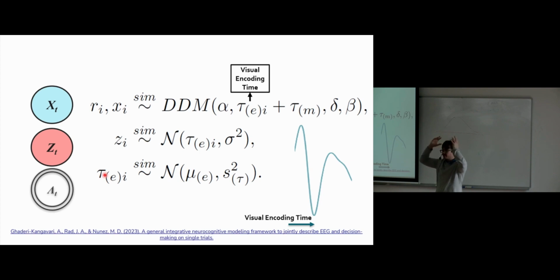Now that problem is classically unidentifiable, meaning that you can't solve that problem without making some assumptions like single dipoles. So if you put that into Bayes Flow and you allow it to have multiple dipoles anywhere, then you would have this unidentified model.